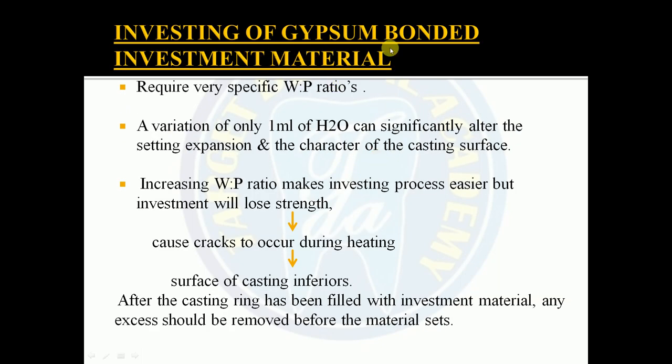Coming on to the investment of the gypsum bonded investment material, it requires very specific water powder ratios. A variation of only 1 ml of water can significantly alter the setting expansion and the character of the casting surface. Increasing the water powder ratio makes the investing procedure easier, but the investment will lose strength. It will cause cracks to occur during heating, which results in an inferior casting surface.